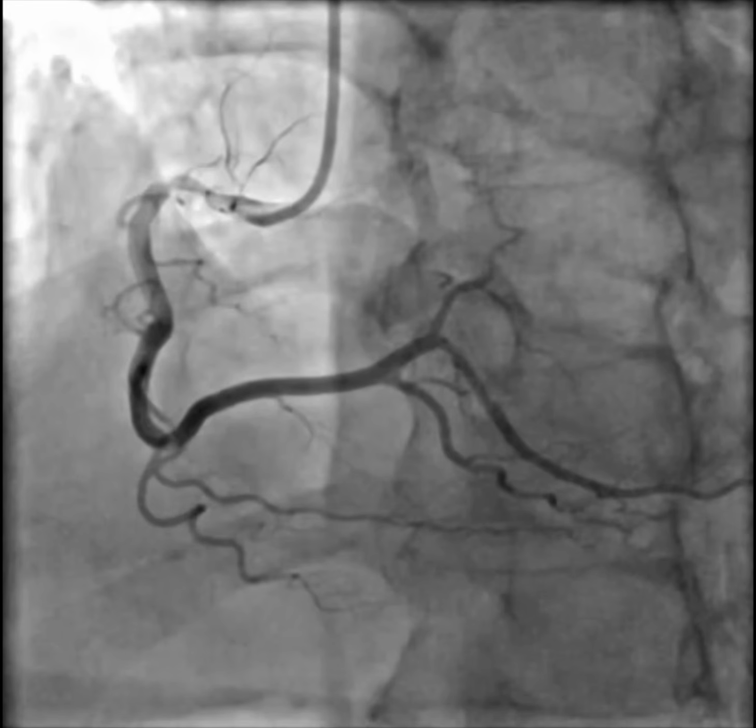So in the cath lab, if you're sitting there wondering what's causing this patient's symptoms, you have to use additional context, not just the angiography, which could be easy to overlook, but also asking yourself, are all the territories accounted for?